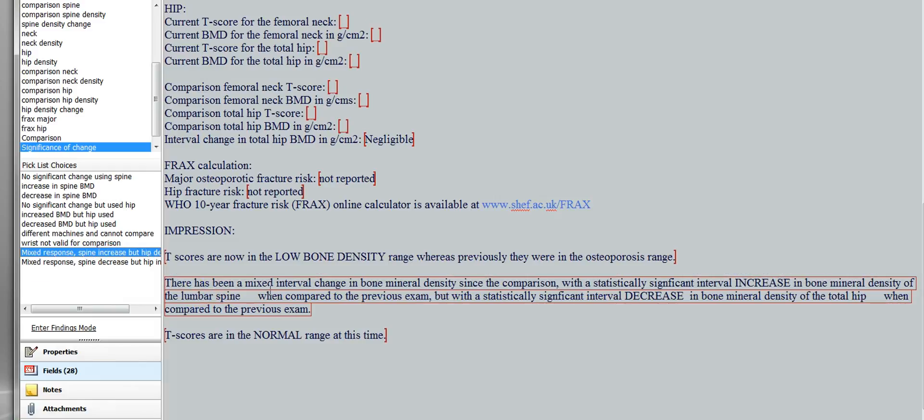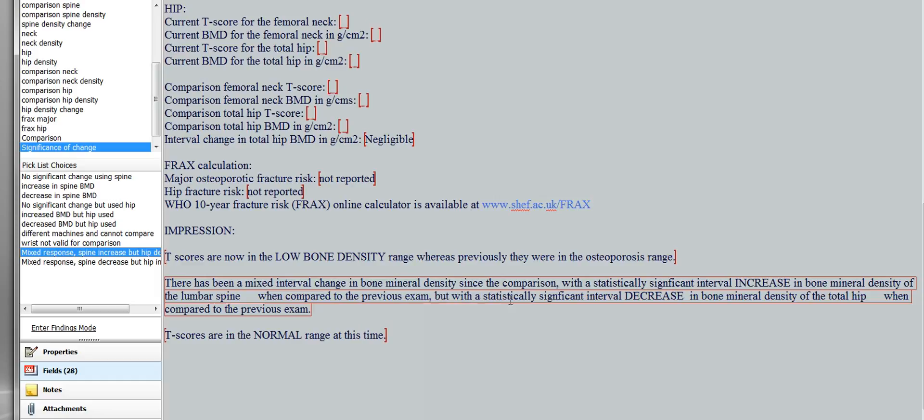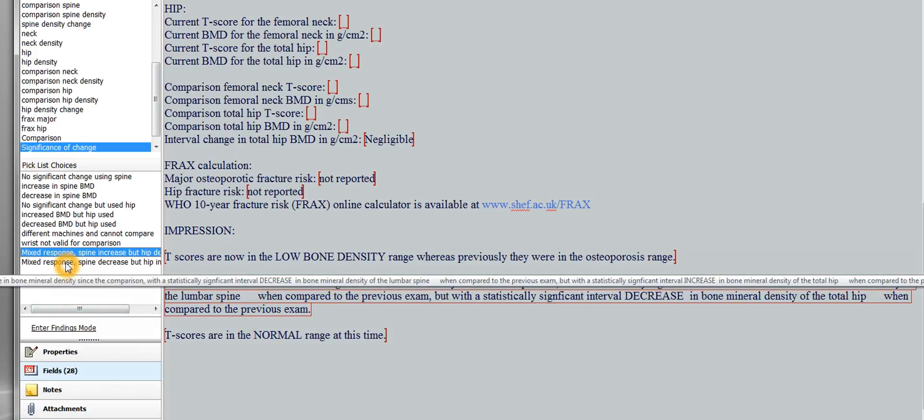Put the values of 0.05 grams per centimeter squared, or 5% when compared to the previous exam, but with a statistically significant interval decrease in bone mineral density of the total hip, and put it in there, of 0.01 grams per centimeter squared, or 7% when compared to the previous exam. So that's the idea. Of these pick lists, and they're pick lists.